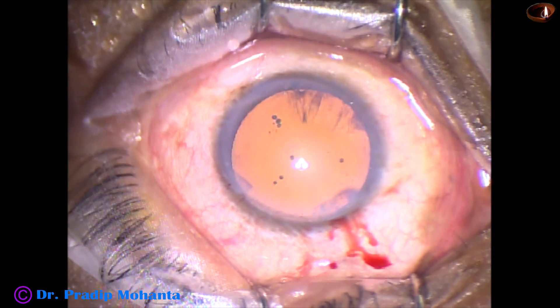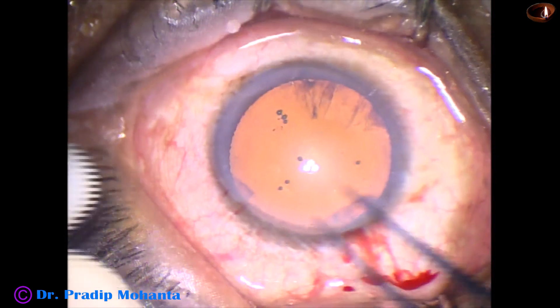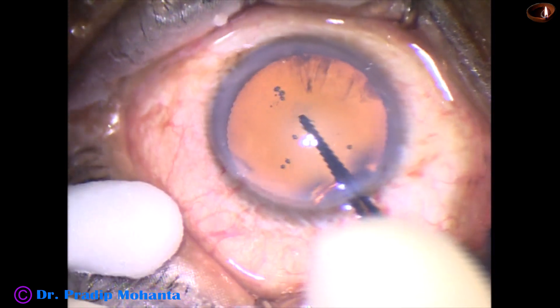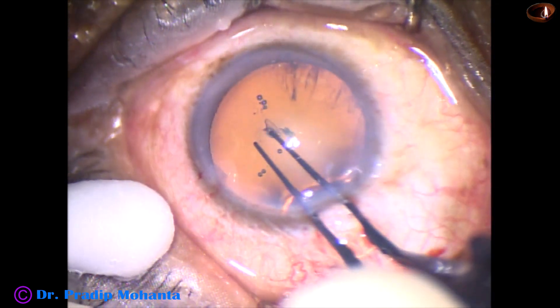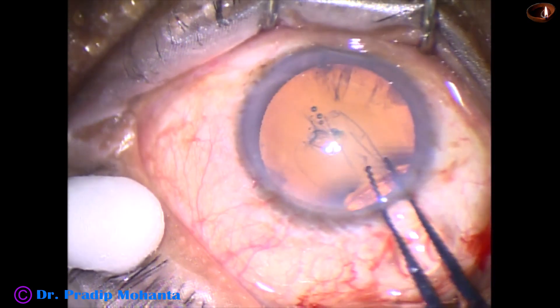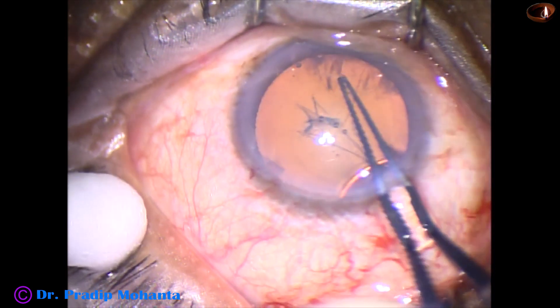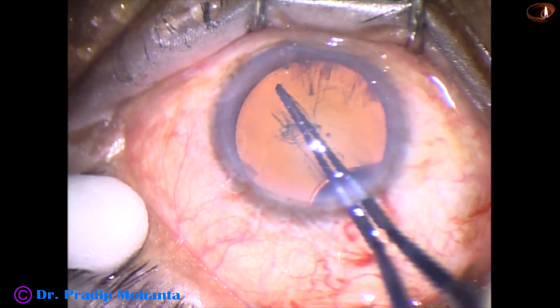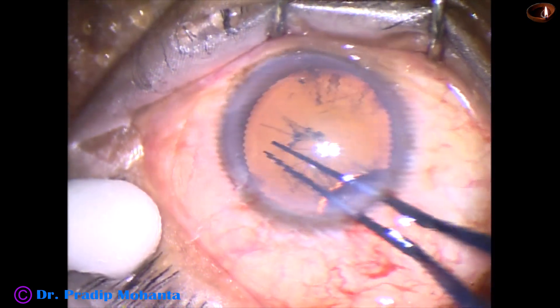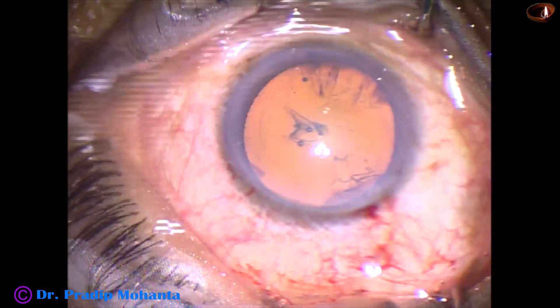And now, capsulorhexis is to be done. A utrata forceps is being used to do the rhexis. The anterior capsule is torn. A capsular tag is raised by the tip of the utrata. The capsular tag is held, it is guided, and here at 7 o'clock it went to the periphery — it could be brought back easily — and a continuous curvilinear capsulorhexis has been done.